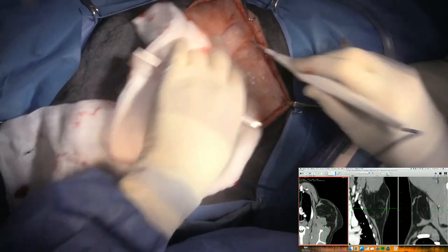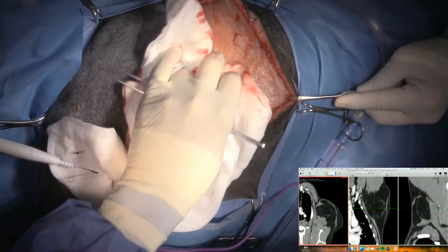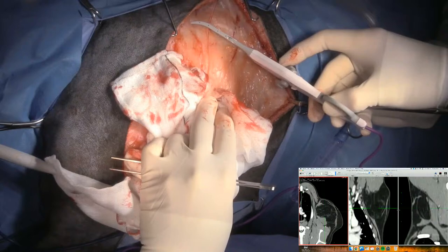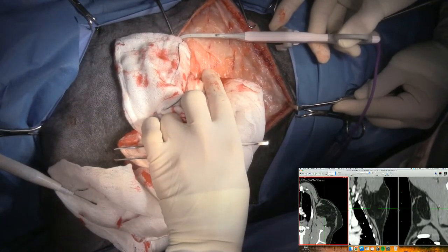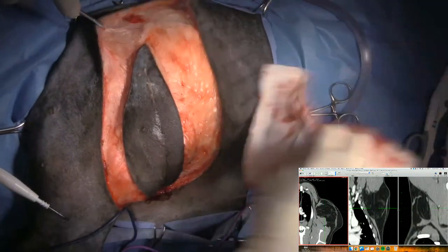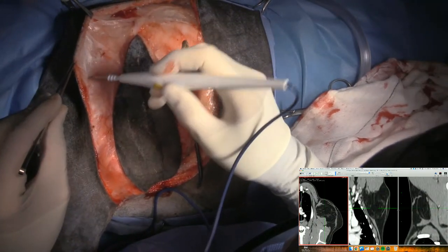Down to latissimus dorsi here. That's the thoracodorsal artery and vein right there, so I'll ligate through that. Almost like I need Balfours instead of Gelpies.